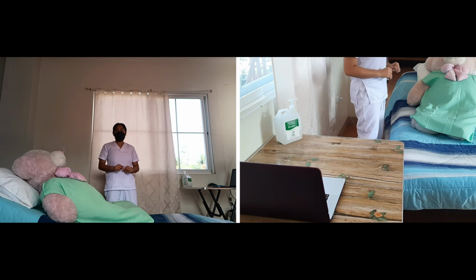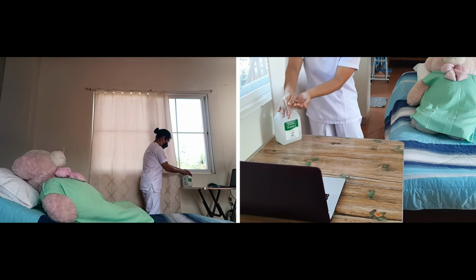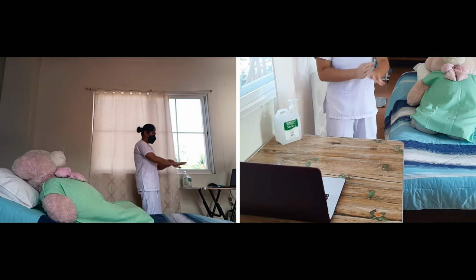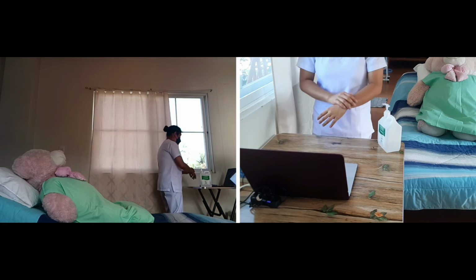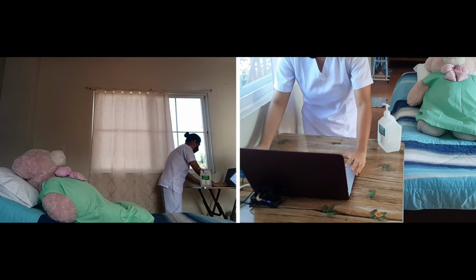Then after that, it is finally time for hand hygiene. And for the documentation, let's put the type and size of catheter and balloon.